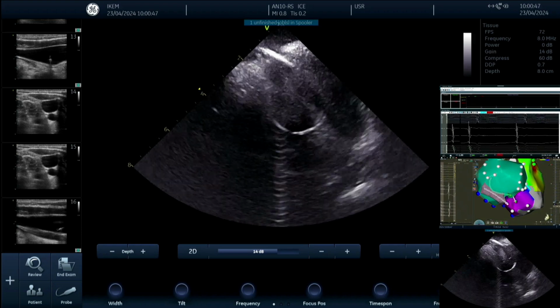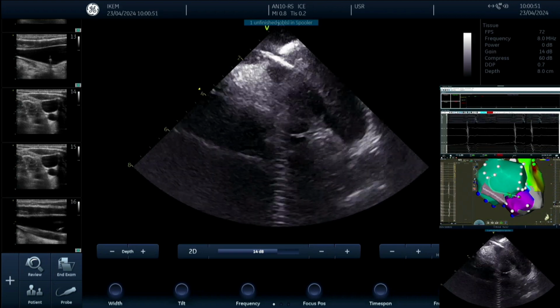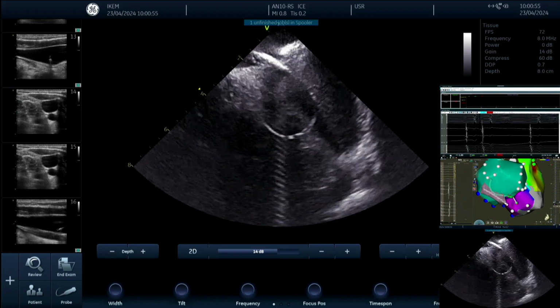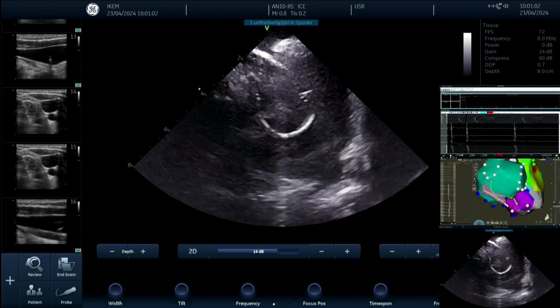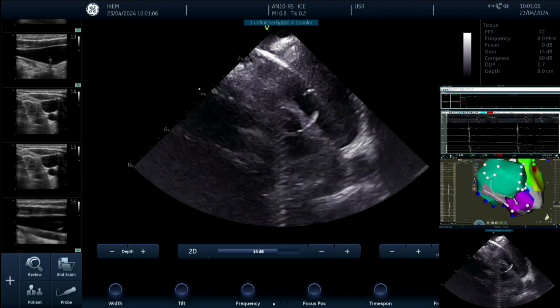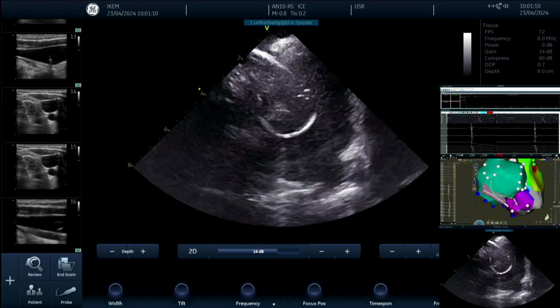Last year we obtained the cardioneural denervation, so Victor, we are going to the extent ablation. So let's burn. We have 10 grams. The force is 7 to 10 grams, and I think the settings are 35 watts and up to 500 of ablation index.